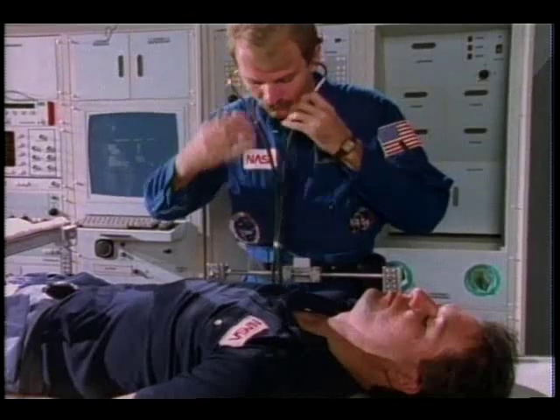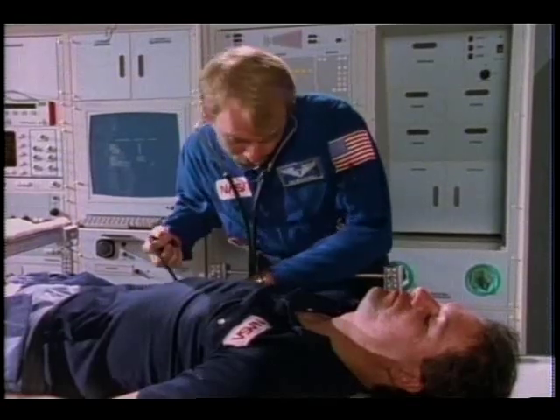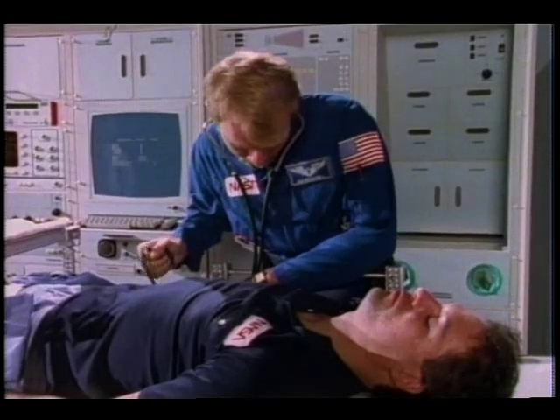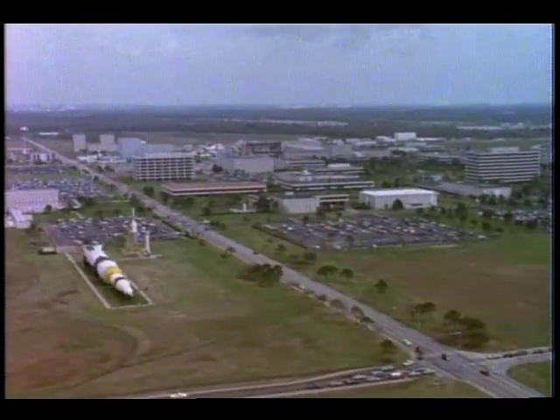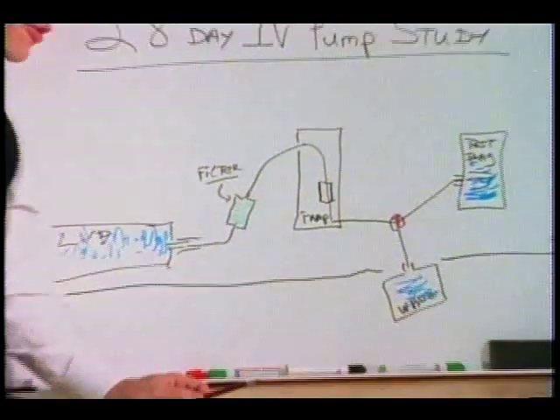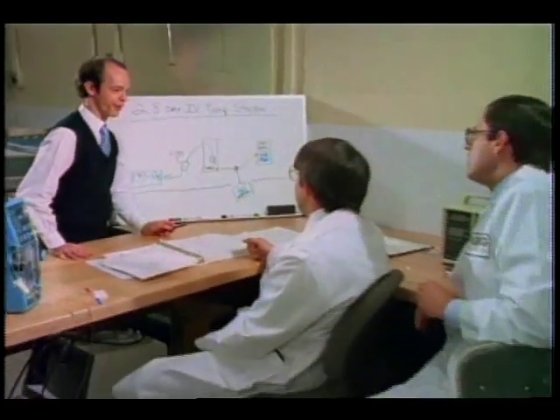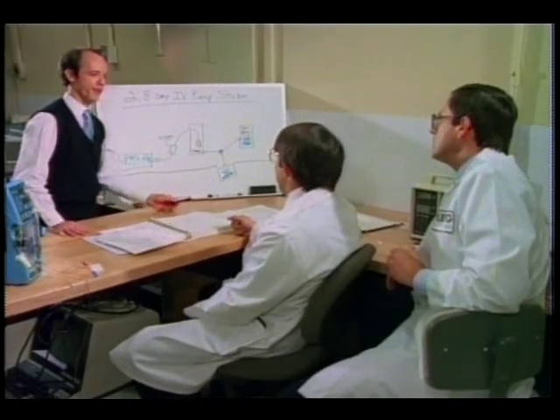The Space Station Health Maintenance Facility, or HMF, will provide necessary in-flight medical care, including prevention, diagnosis, treatment, and care during transport if the patient must be evacuated. The HMF is currently under development by NASA at the Johnson Space Center in Houston, Texas. Because of its specialized function, the HMF is being designed primarily by a team of NASA physicians, biomedical engineers, and other allied health professionals.